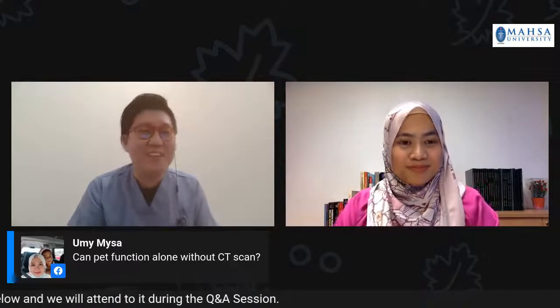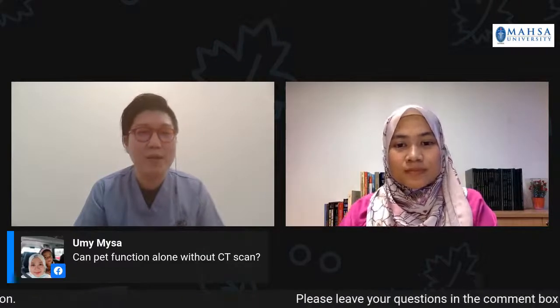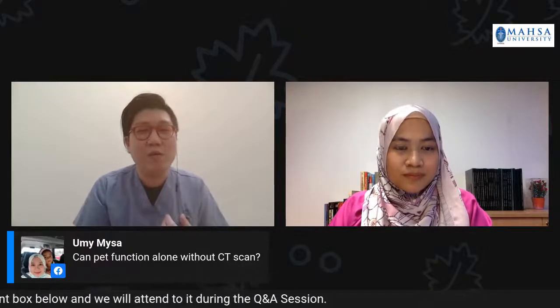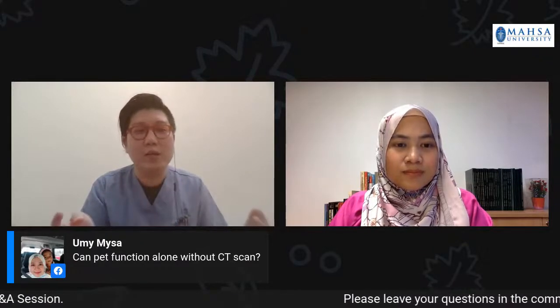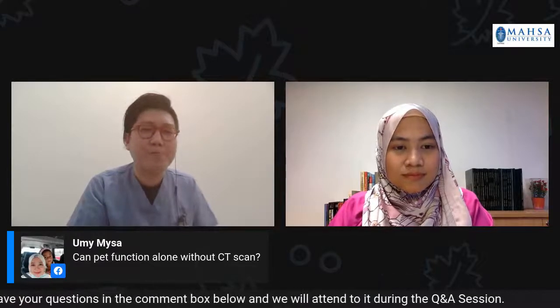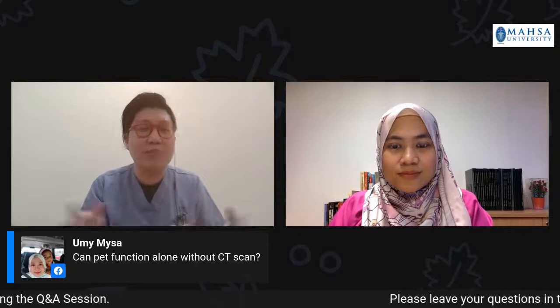Can PET function alone without CT scan? Yeah. Back in those days, a long time ago, PET functioned on its own. But as you can see, when I shared those images, with PET stand-alone, it's so difficult to tell the anatomy, to tell the localization of any abnormalities. So therefore, with the current technology, usually we will fuse PET and CT together. There's a greater benefit when we do both together to get better images. I never really operated a machine with just PET alone, because nowadays with technology, it comes together with CT.